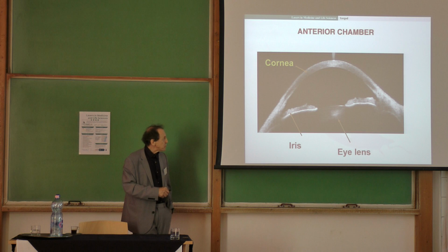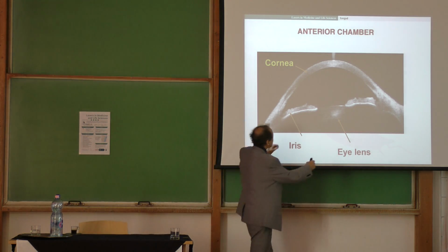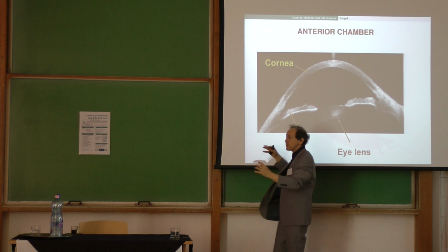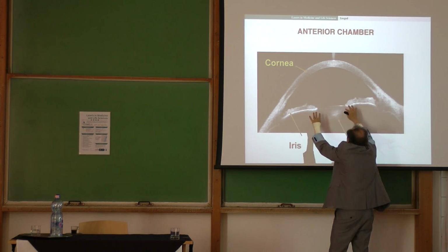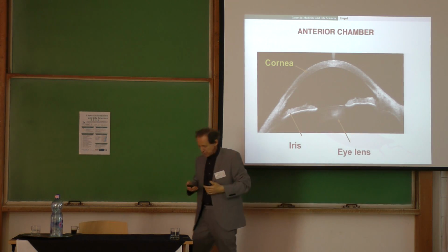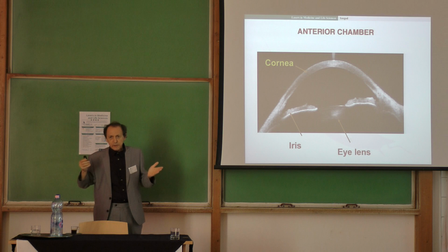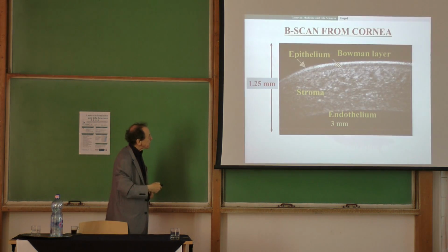Yes. So if you turn on the light, the iris will try to restrict the light going to the retina. So you'll see this in real time moving. If you go into the dark, this will retract. You can see that in real time. It's not like in CT where you have to wait for the image to be calculated. So it's real time. It's a real time instrument.